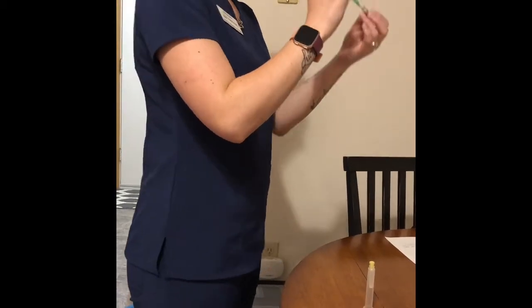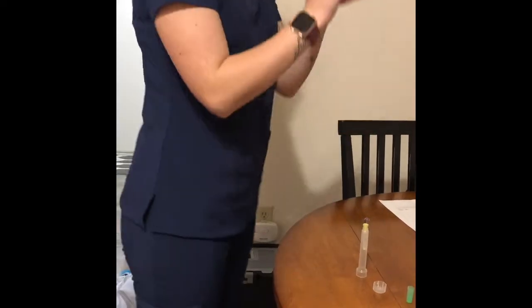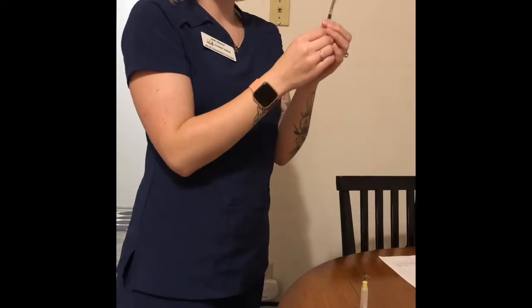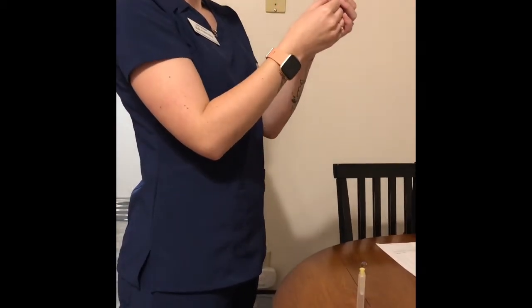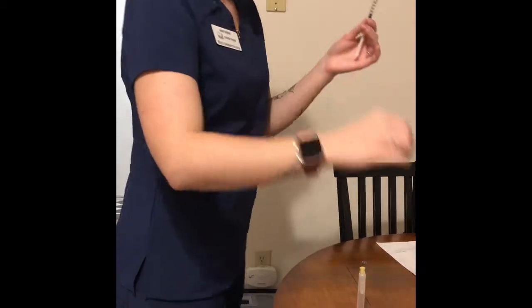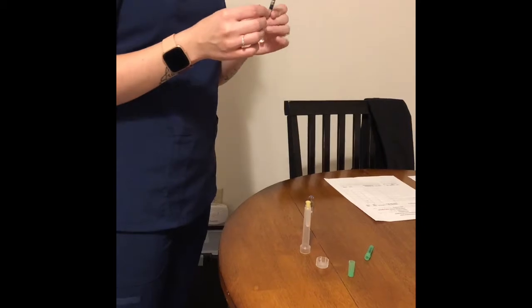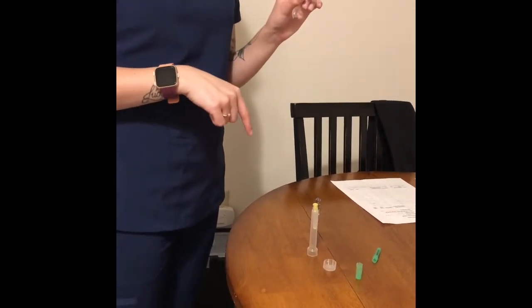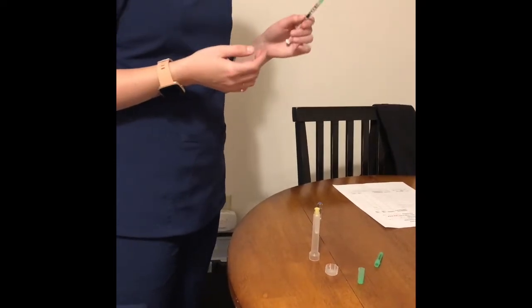Okay, you are good to tap back. So I have 0.5 milliliters of the heparin shot, and I have 0.2 milliliters of air. At this point, you want to put your other needle back on. You cannot do injections with a filter needle.